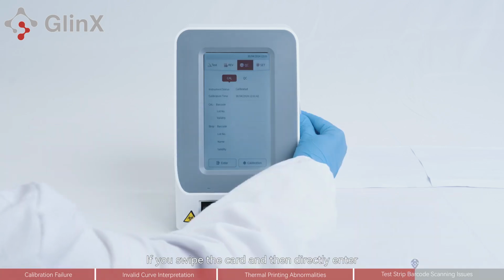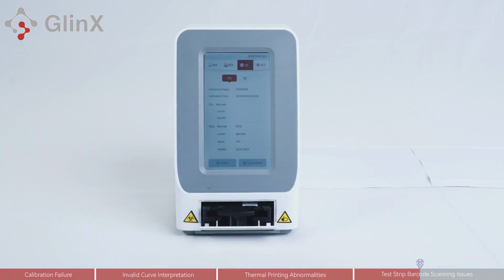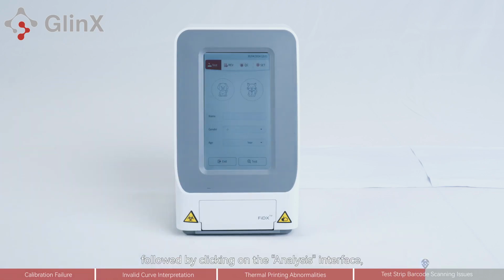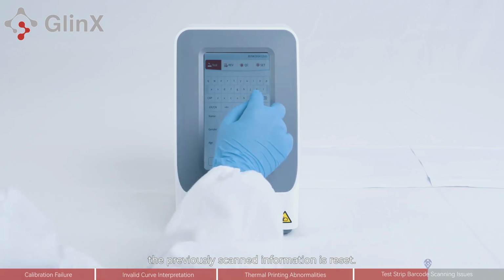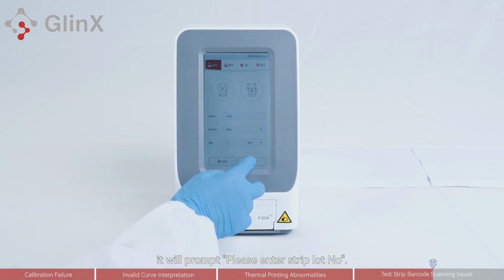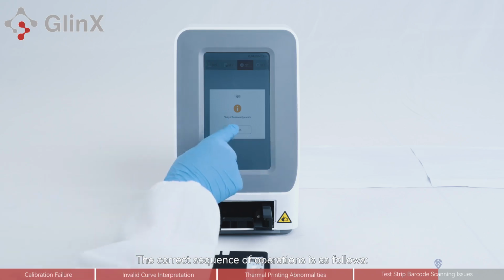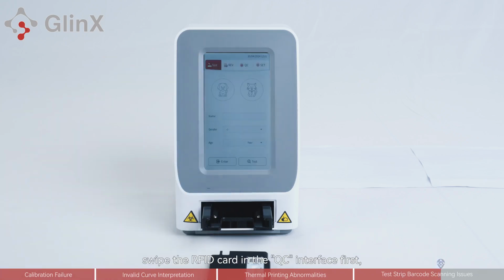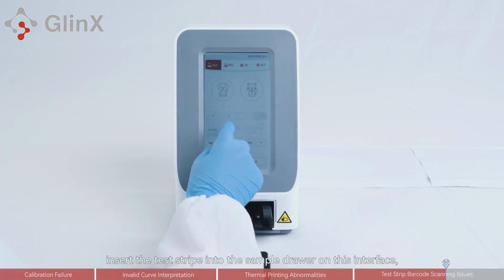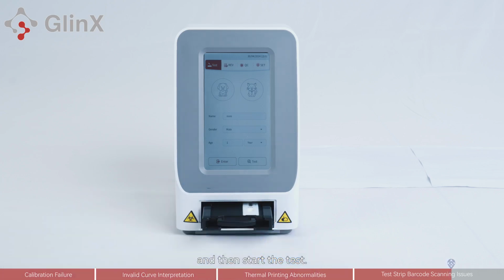If you swipe the card and then directly enter the sample drawer from the QC interface, followed by clicking on the analysis interface, the previously scanned information is reset. Consequently, when you click Test, it will prompt, "Please enter strip lock no." The correct sequence of operations is as follows. Swipe the RFID card in the QC interface first, then click Test. Insert the test strip into the sample drawer on this interface. Input the basic animal information, and then start the test.